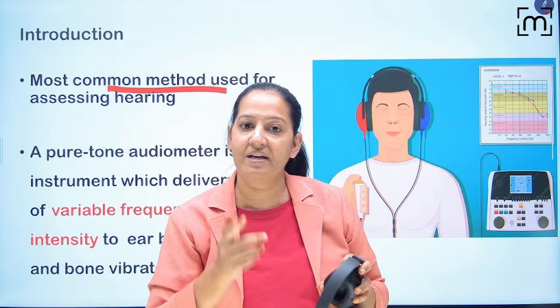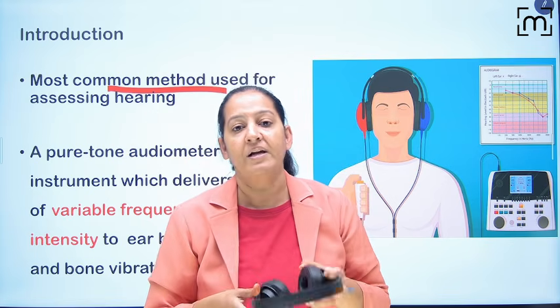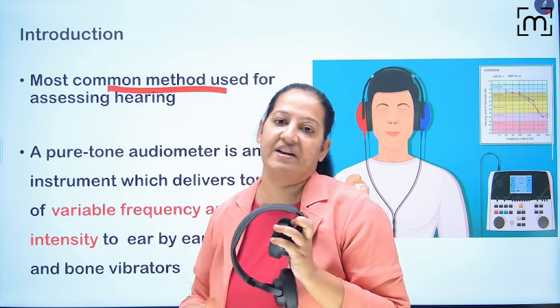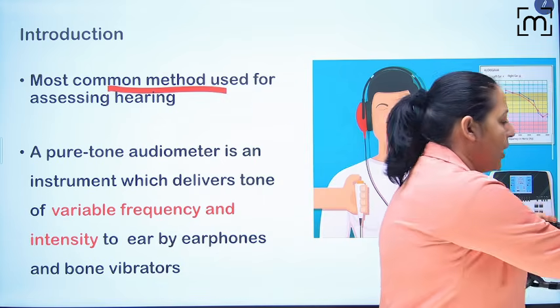So this is how we perform. We perform in both the ears one by one with the help of headphone. In the headphone, we play sound of different frequency and different intensity. You are getting it? So this is how it is performed.